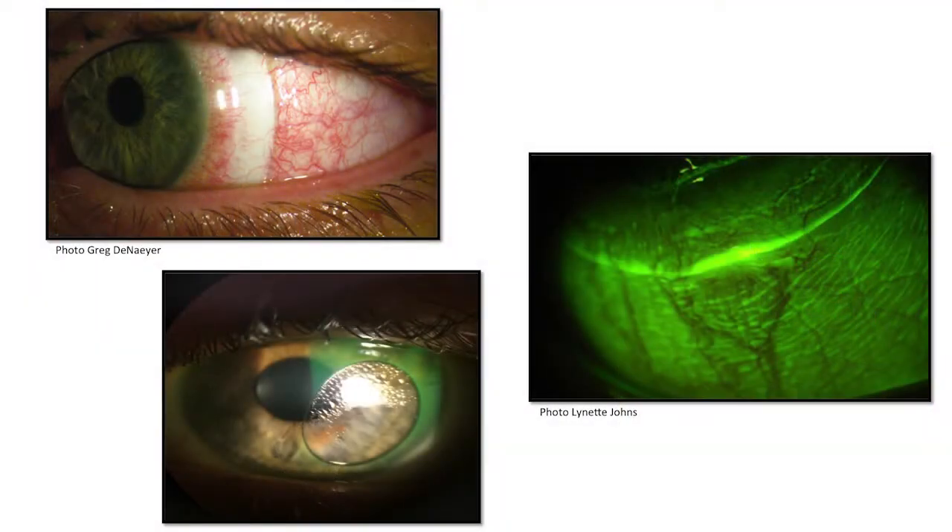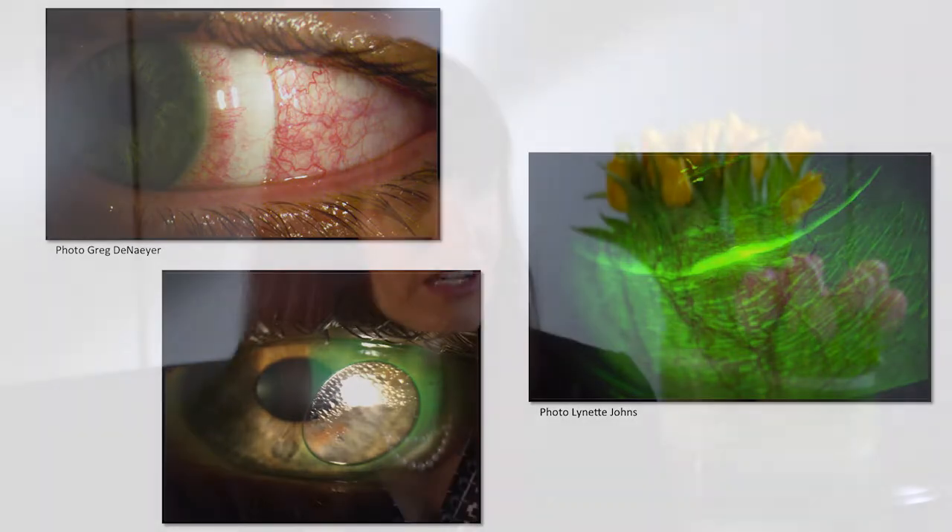We also talked about the conjunctiva. Here you can see examples of blanching or whitening and impingement, where the edge of the lens digs into the scleral conjunctiva. We have learned that utilizing toric peripheral curves and actually flattening out the peripheral curves really helps the scleral lens land more evenly on the scleral conjunctiva.